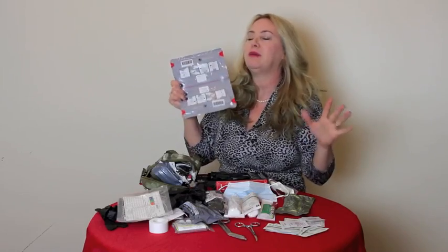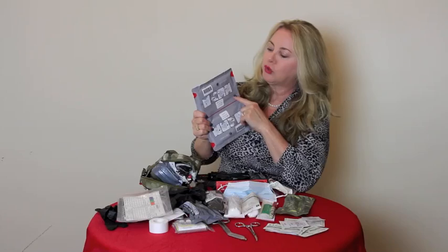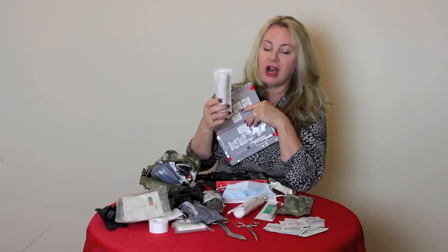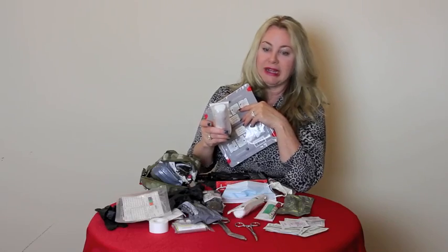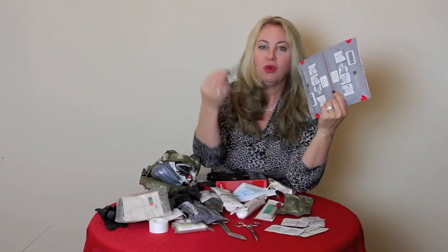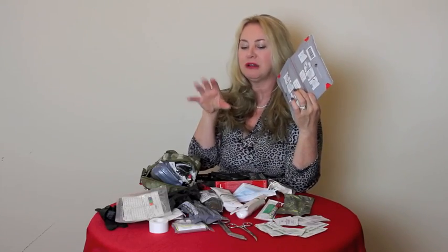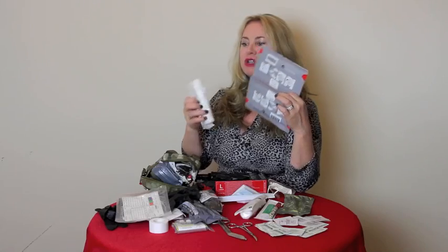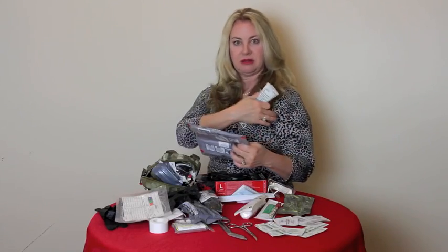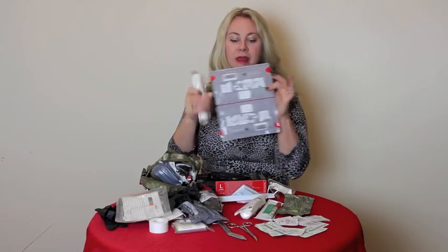You have instructions. You haven't done this before, you're not sure what to do, or you just forgot. You had great training, but everything left your head, and you're thinking, what do I do? Flip it over. Four easy instructions. One of the first, wipe the area. You've got gauze. If it is ooey gooey from blood, this isn't gonna stick so well. So you need to dry it. Don't wipe it with alcohol or betadine wipes. Yes, you're cleaning the area, but it's not about cleaning, it's about having good adhesion. So use some of this gauze if there is blood or something else around there. Clean it up, put the one side on.